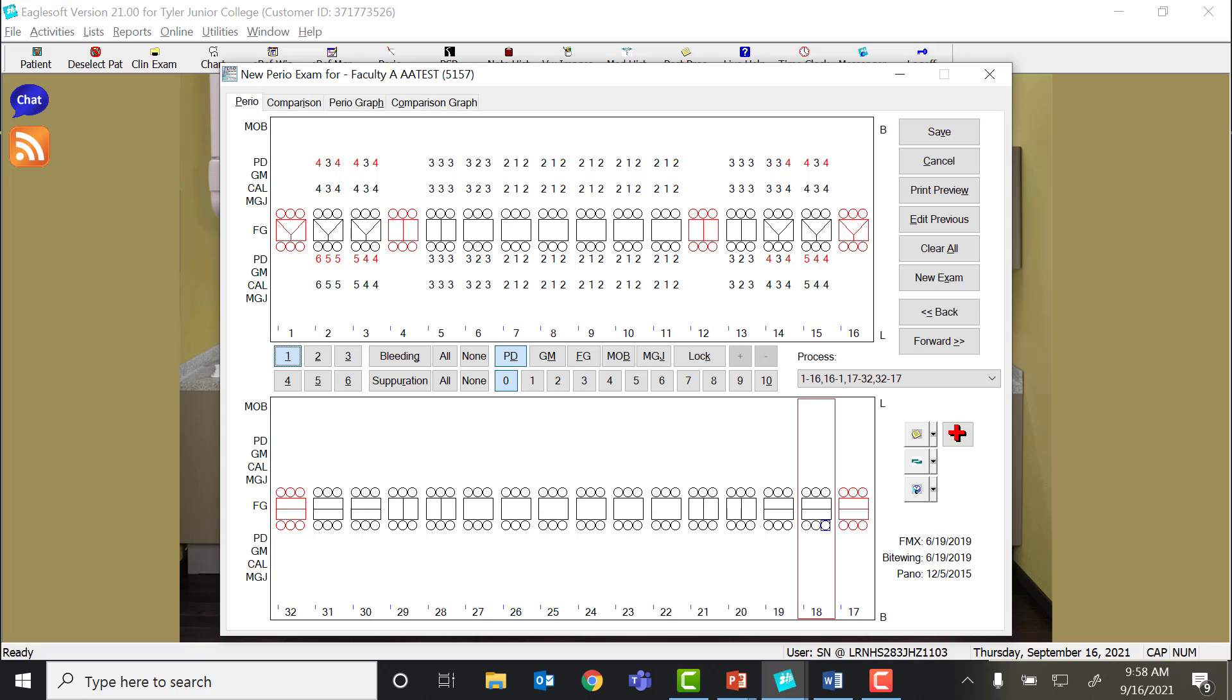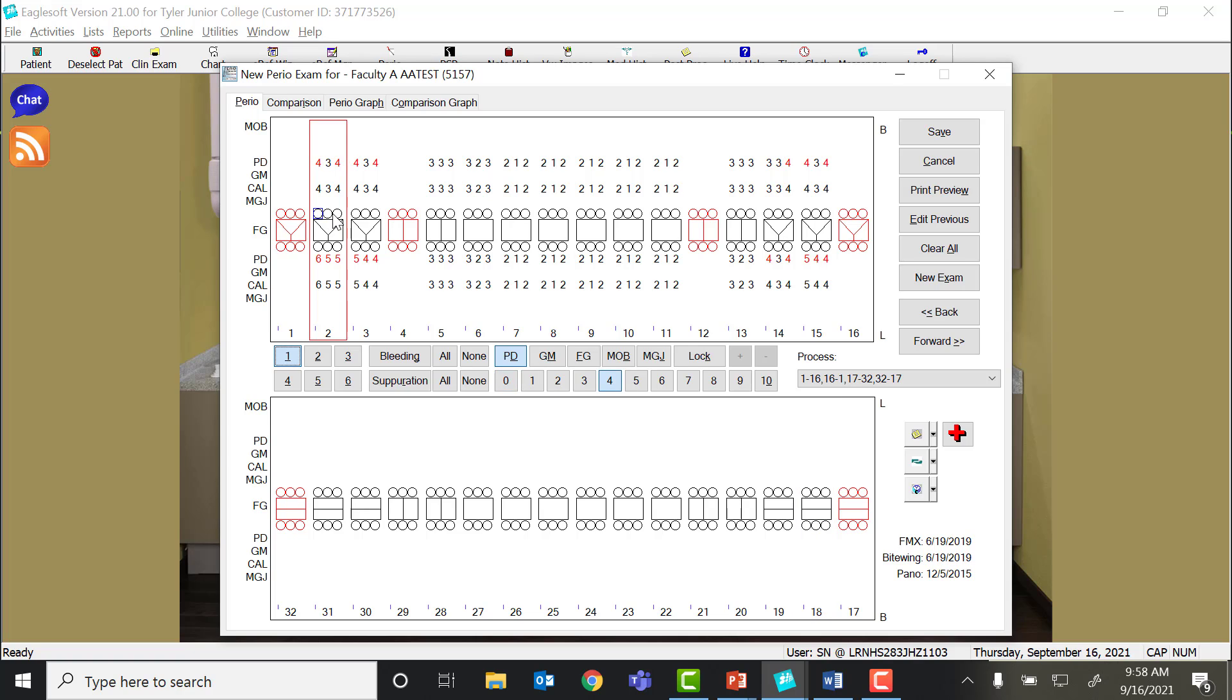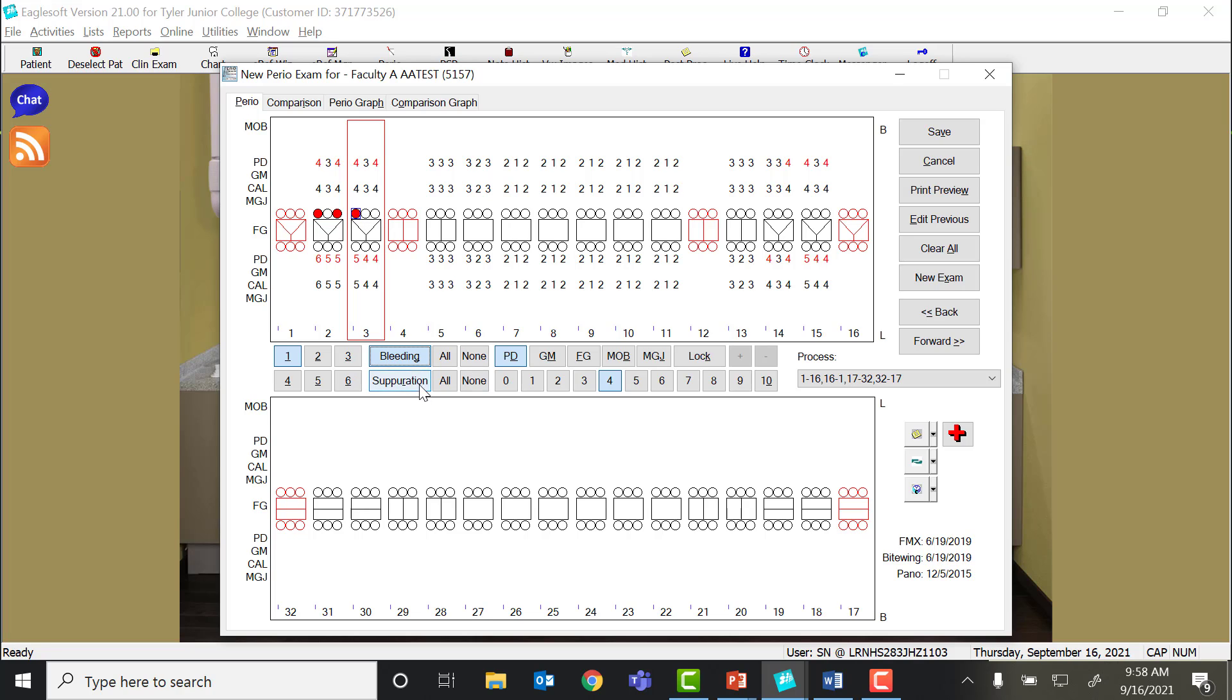As you are probing along, it's important to document the bleeding, whether it's spontaneous upon probing or whether it's delayed. If it's delayed, you can go back, select the areas that you had bleeding, and put in the bleeding spots. If you're doing it as you go, you can type in the number and type in the bleeding spot as well. There is a shortcut for that, and you have to do the shortcut letter prior to typing in the number.